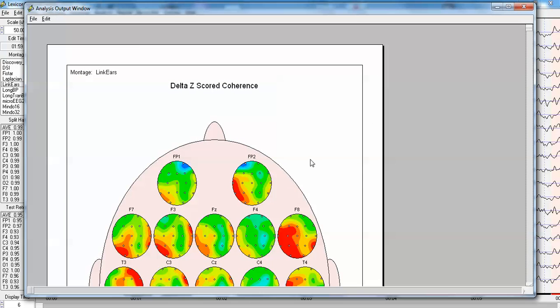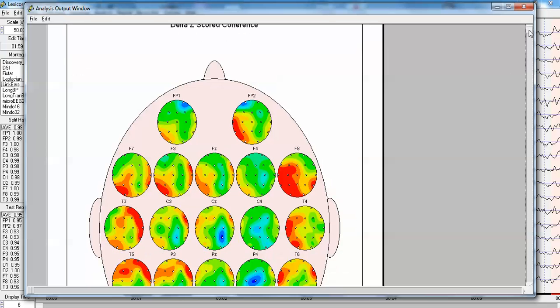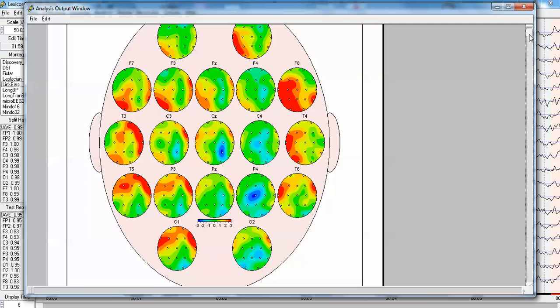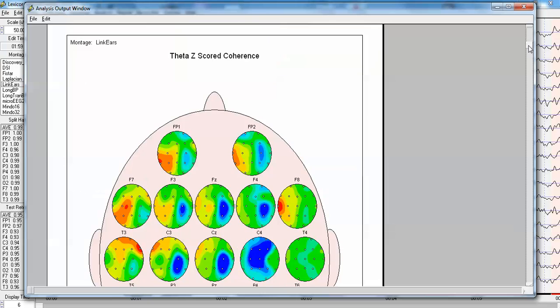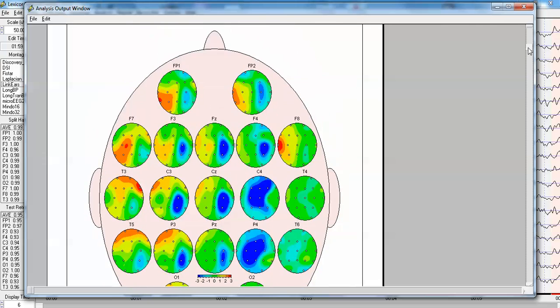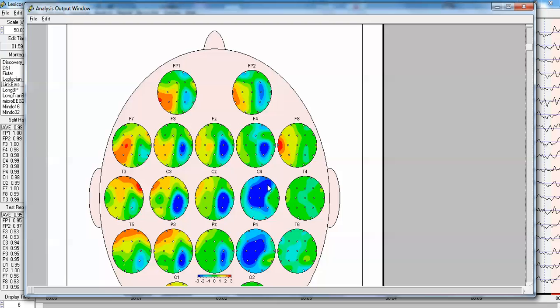And we see here now delta coherence, and we're going to come down, and when we do, we'll see that there's two or three standard deviations reduced connectivity in the right parietal lobe because of the damage. And in the theta band, where we were looking earlier at the traces, and you can see this deviant dysregulation in the right parietal lobe, there is very low connectivity for the central lobe with respect to other regions of the brain.